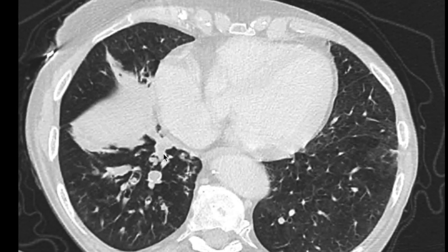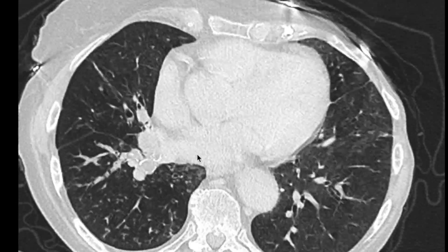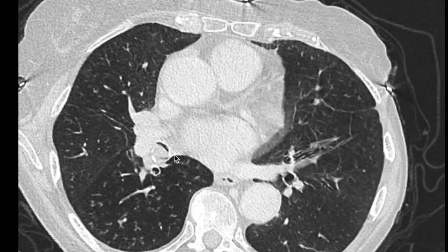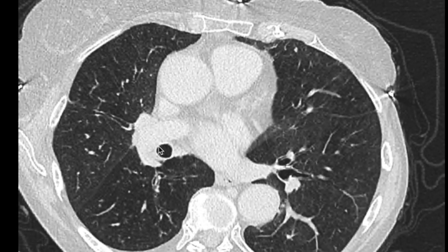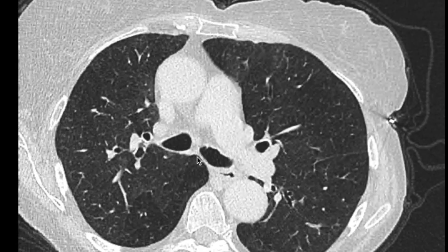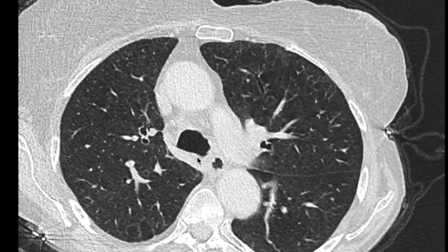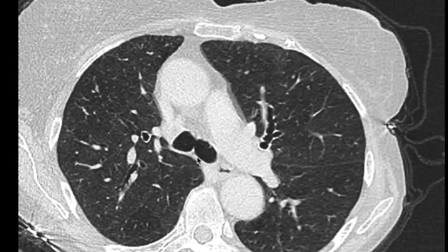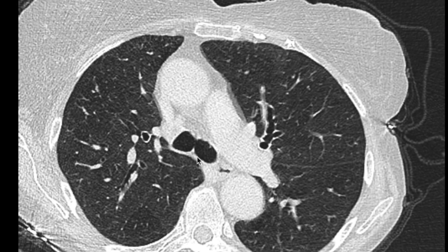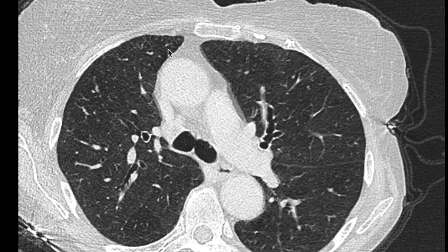In the setting of having malignancy in the past, a metastasis is of high concern, but this appearance could also be from mucus plugging, so we really need to perform bronchoscopy to have a look. I decided to do this with a rigid bronchoscope to be prepared if there is a tumour to be able to resect that away.